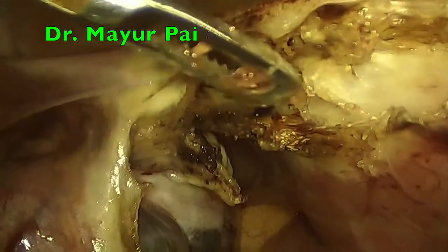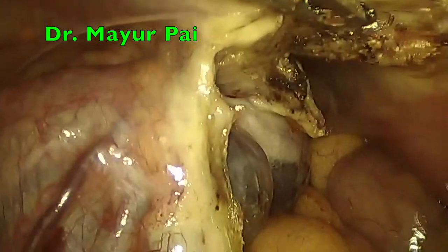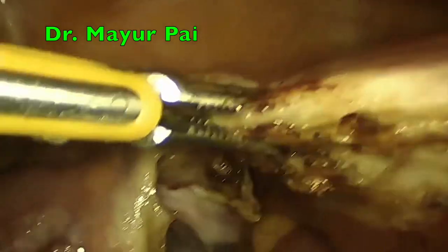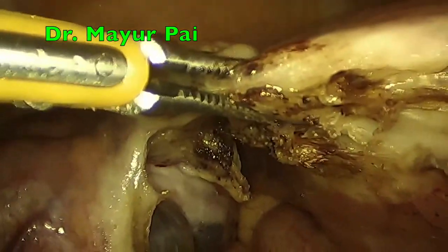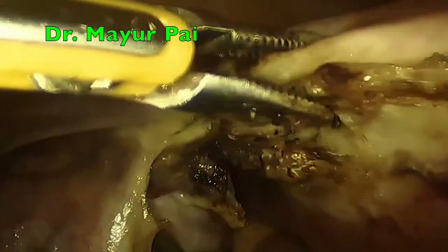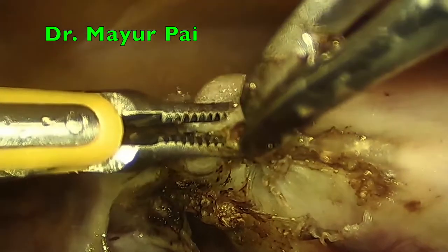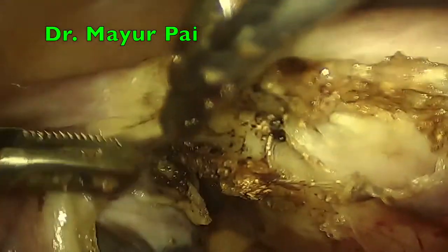Now we are putting a stretch on the uterus so that the round ligament presents to us in a better way. We are coagulating it with our standard bipolar forceps. Again, the trick is the same. We give a slow coagulation burst followed by cutting with the laparoscopic shearer.